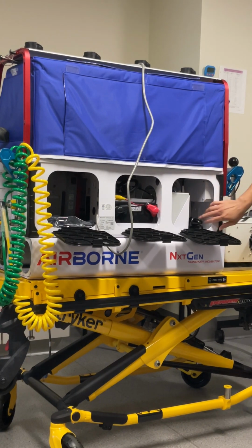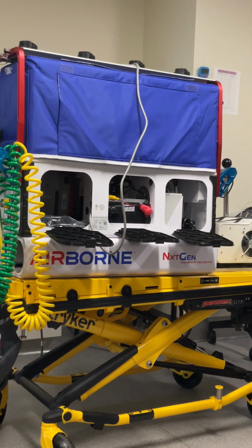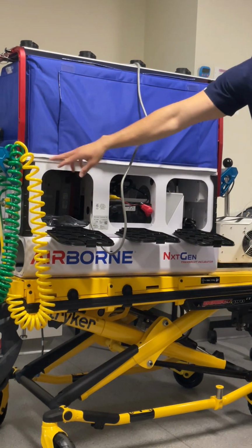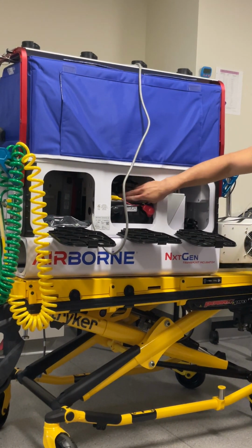So this is where we're having our suction now. That's where the specimen cup is. And here's the thing: the suction is entirely run in the front. We turn it on in the front. The light is turned on in the front, so everything. There's no switch back here, nothing like that. It's all in the front. It's a mucus trap suction. There is a little red button here.